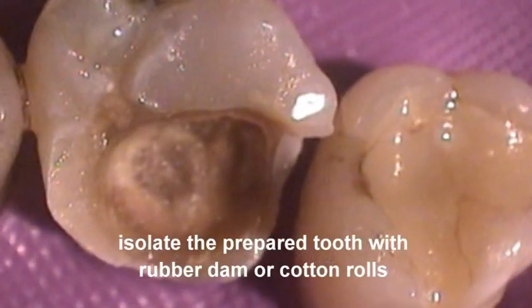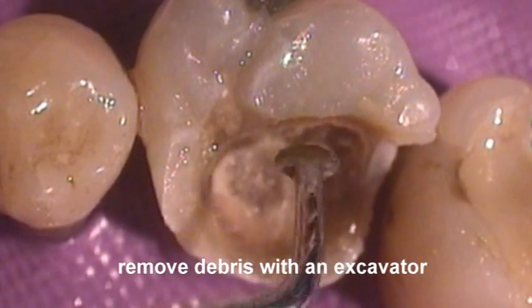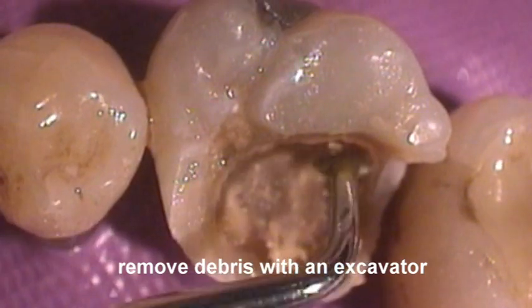Isolate the cavity with either rubber dam or cotton rolls. Remove superficial debris and the surface layer of caries with an excavator.